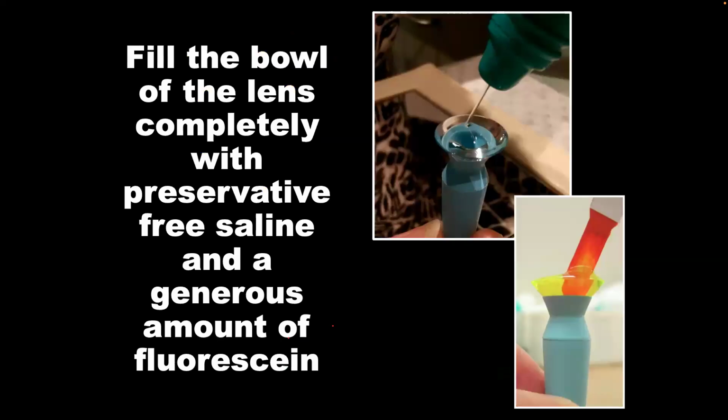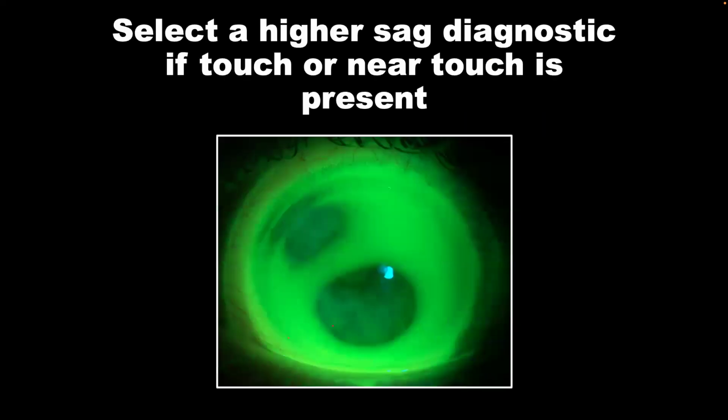But if I were to see this, I wouldn't go just 200 microns. I probably would go 400 microns more, because I know I have touch, and I know it's going to be an asymmetric fluid reservoir, because inferiorly we have that touch and superiorly we don't.